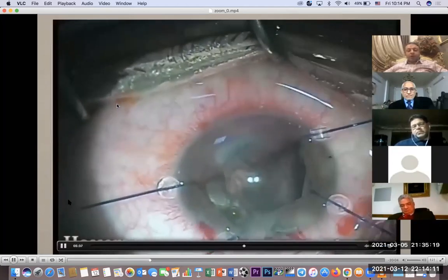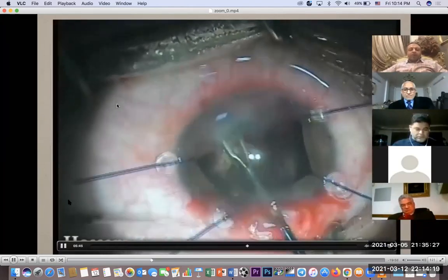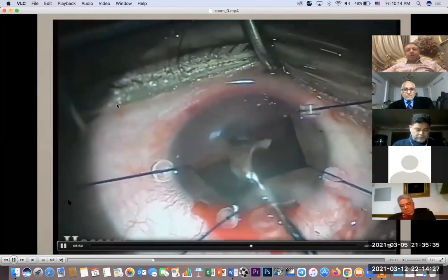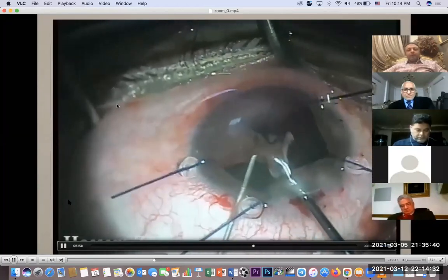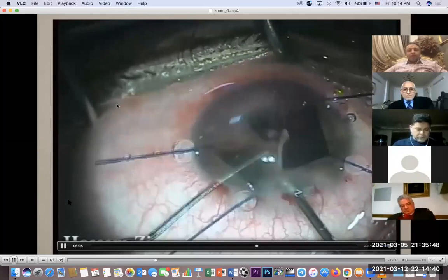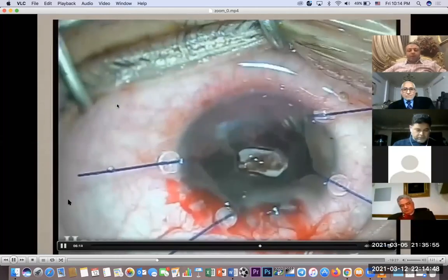Finally, I got this microforceps, the microrhexis. It was very helpful to catch the membrane and try to peel it from the anterior iris. But at the same time, keep in your mind not to be aggressive. You can peel the membrane, but at the same time you may get iridodialysis, and I think you will be a big loser if you had it. So I'm trying to be balanced to catch the membrane without getting iridodialysis.